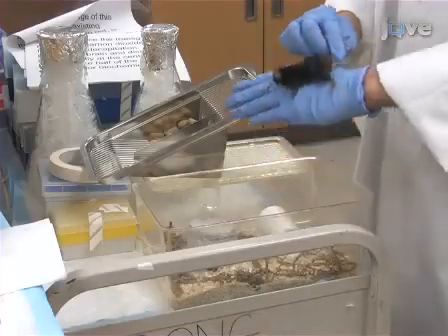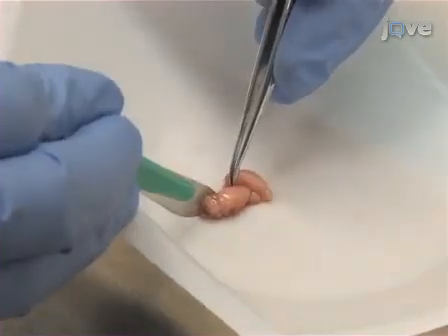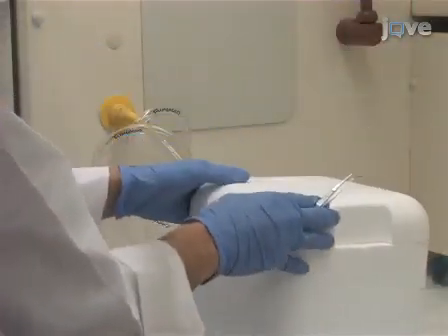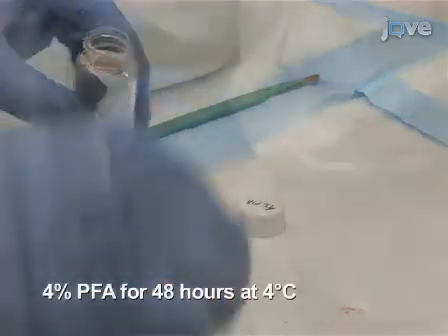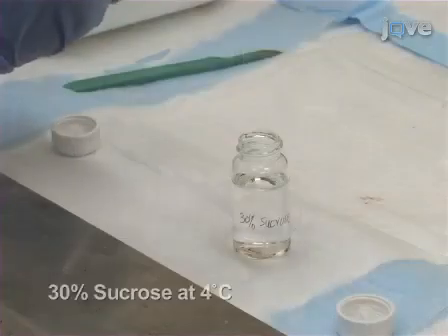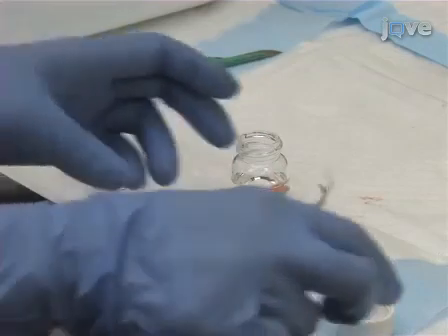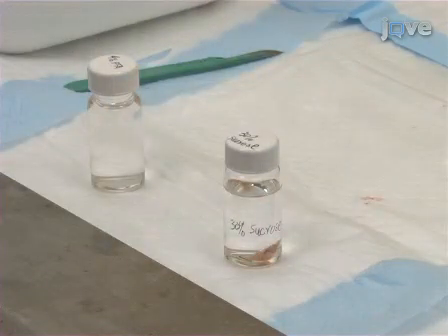Sacrifice the transgenic mice using carbon dioxide gas, followed by decapitation. Extract the brain and dissect it longitudinally at the center. Flash freeze half of the brain on dry ice for biochemical analysis. Submerge the other half in 4% paraformaldehyde for at least 48 hours at 4 degrees Celsius. Transfer the hemibrain to 30% sucrose solution at 4 degrees Celsius. Initially, the hemibrain will float in the sucrose solution, but after 24 to 48 hours it sinks to the bottom.